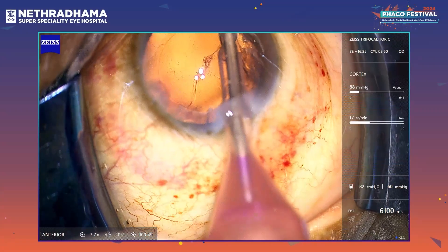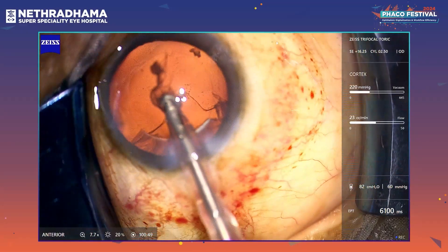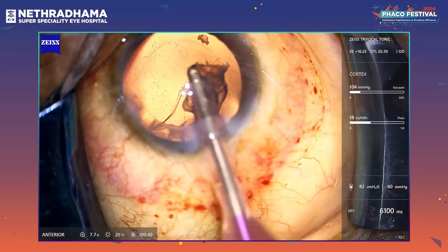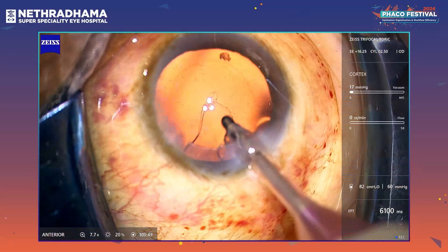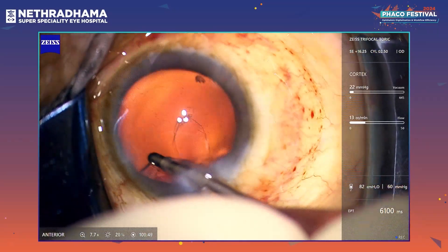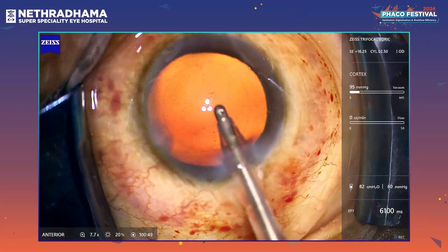I like to use a coaxial IA for the cortical removal in most cases, except very complex cases or mature cataracts where I make the right side port as well. You can see that the sub-incisional cortex with the femto — when we use a femtocapsulotomy — takes a little more time because the anterocortical fibers get cut by the femto as well. The cortex is removed.